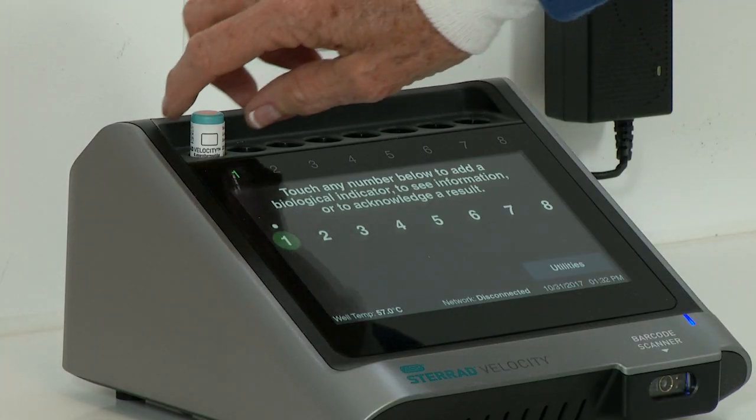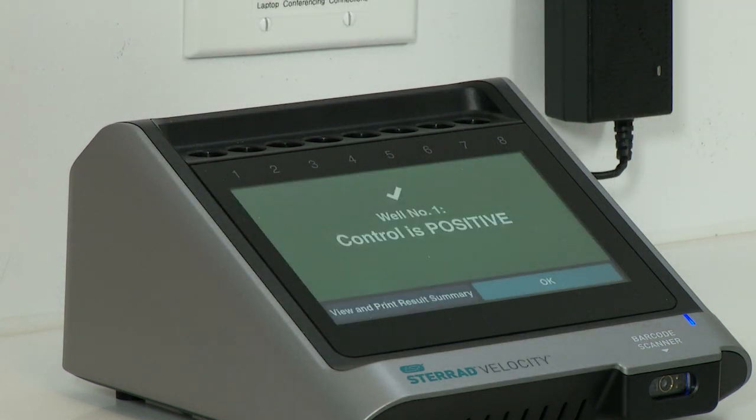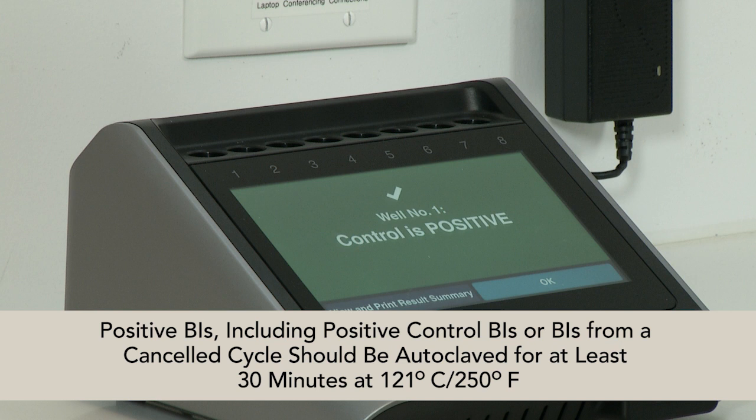Discard STERAD Velocity BI ampules after final reading based on your facility's procedures. Any positive BI, including a positive control BI or one from a cancelled cycle, should be autoclaved for at least 30 minutes at 121 degrees Celsius (250 degrees Fahrenheit), or per your hospital or healthcare facility's policies and procedures.